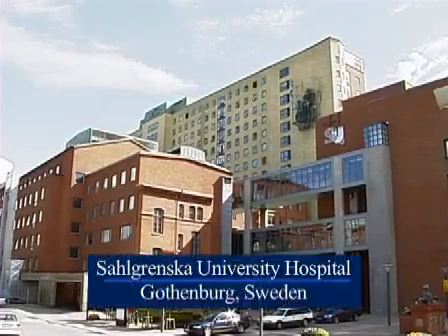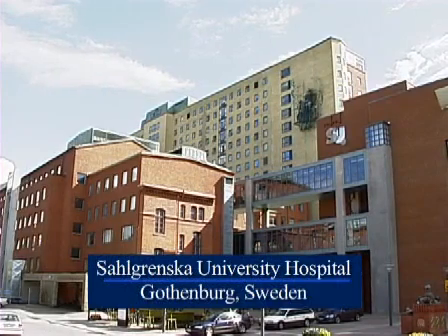Welcome to the Department of Pathology at Sahlgrenska University Hospital in Gothenburg, Sweden. I'm Dr. Claes Norby, and the method that you are about to see has been developed in my laboratory.